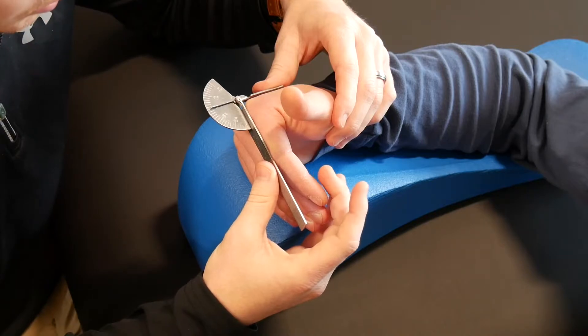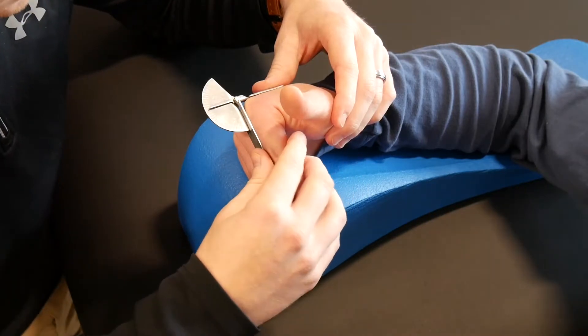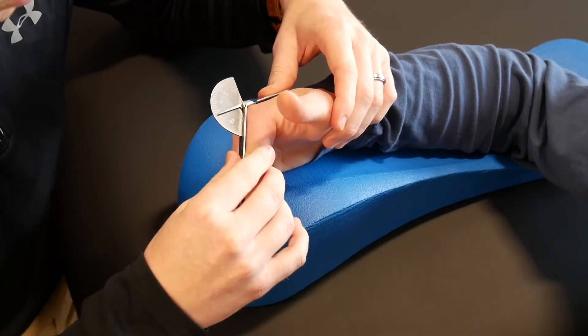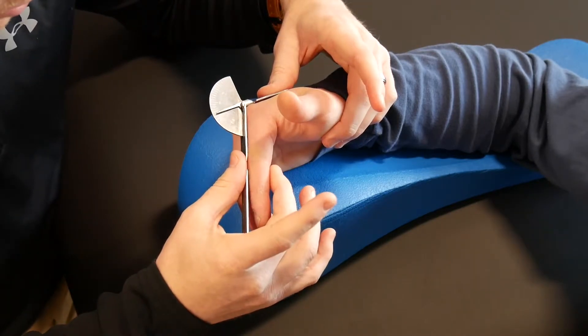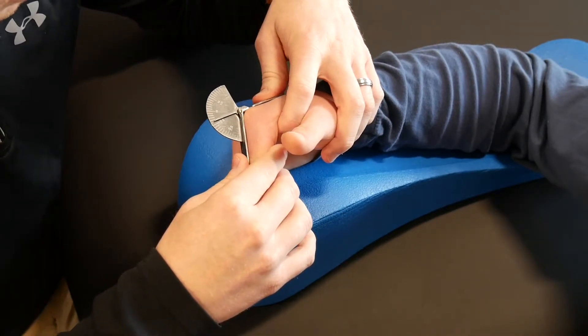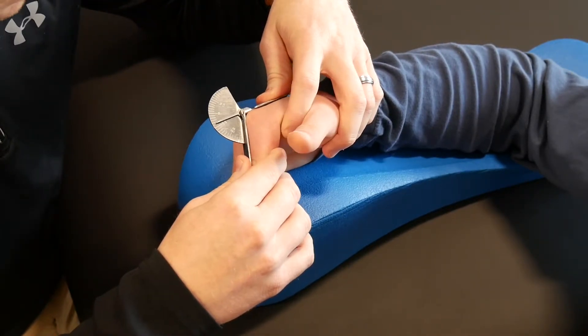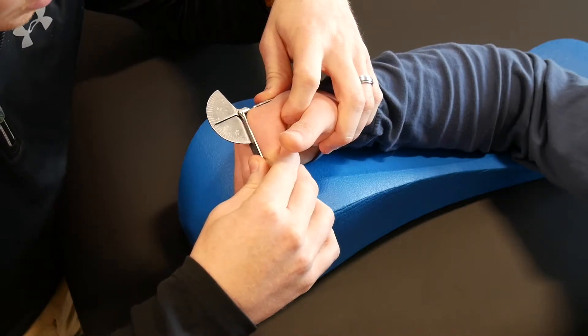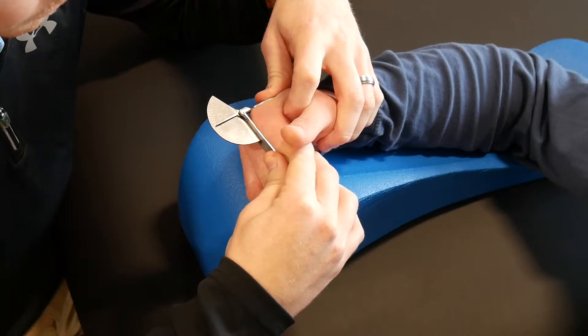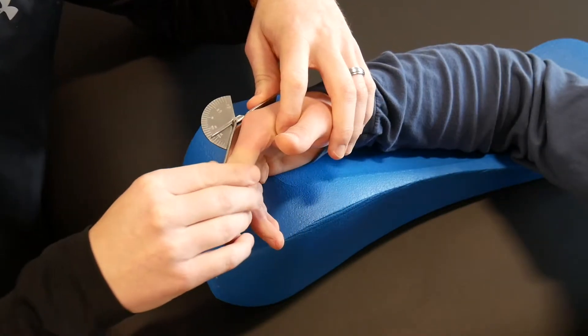He's got normal motion — that's right at 90 degrees. If he did not have normal motion and there were no restrictions or precautions, we can measure passively. I'm going to stabilize on the stable end and just take his finger and the goniometer at the same time to get my passive measurement. Short and simple there.